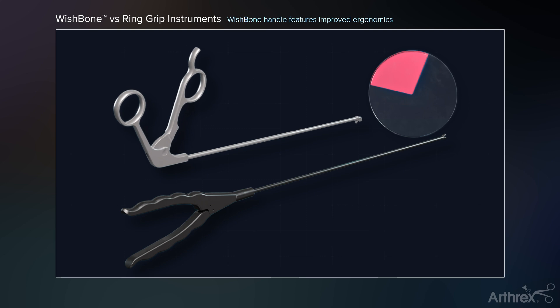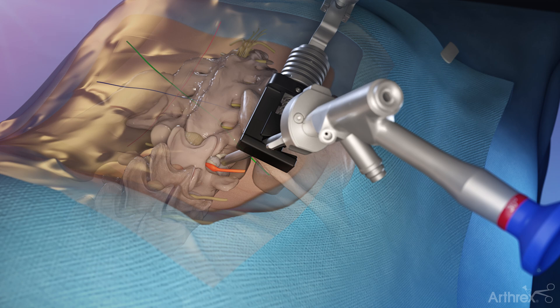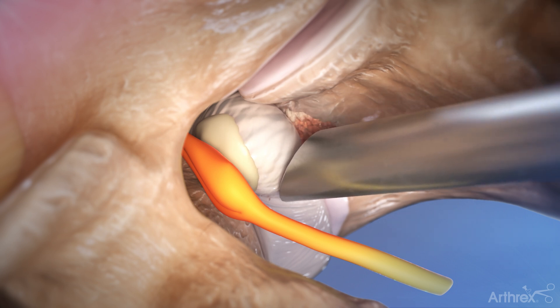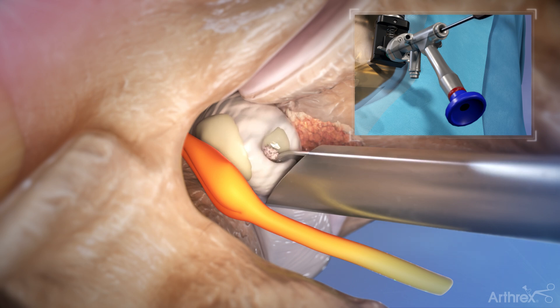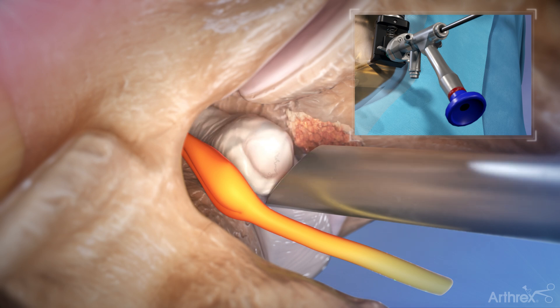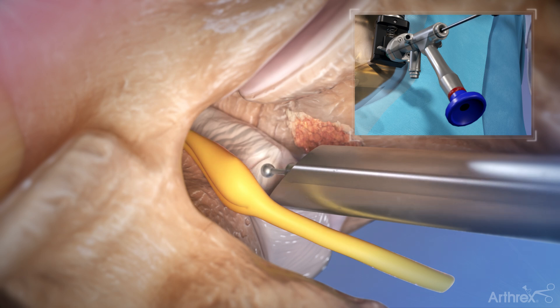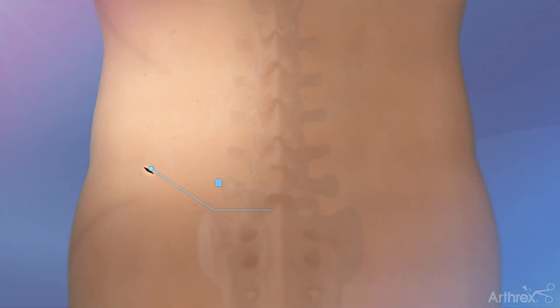Arthrax offers a unique wishbone handle design that allows for improved ergonomics and mobility of the instrument by the surgeon. Upon visually identifying the herniation or disc fragments, apply downward pressure with the cannula over the annular defect. Use various graspers and endoscopic instruments for tissue removal and decompression of the affected neural elements. Use a hook and ball tip probe along with direct visualization to ensure all fragments have been removed and the discectomy and decompression are complete prior to the removal of the endoscope and cannula.